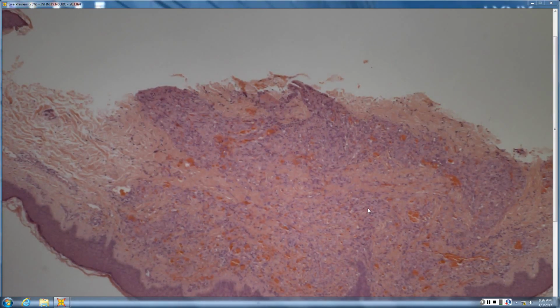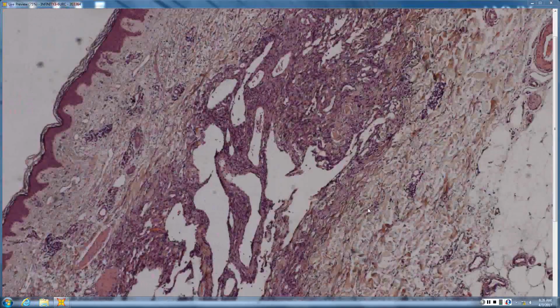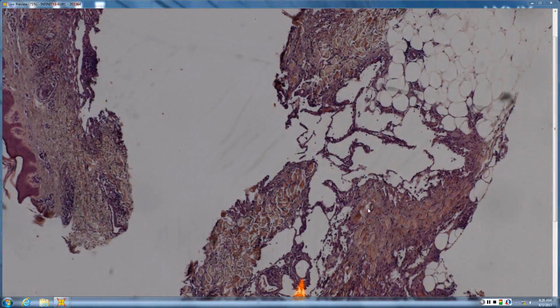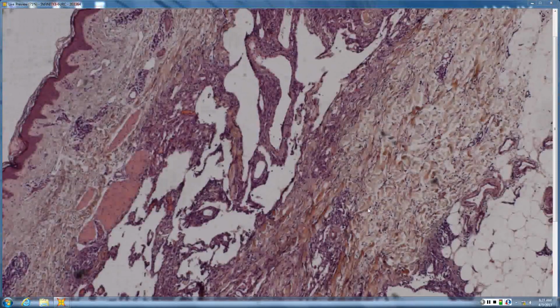Nodular vascular proliferation, nodular KS, or it is a little lobulated, maybe. And definitely around pre-existing structures, and this is an HIV patient and HHV8 positive. The deeper dermis, pretty diffuse. And what would you call this, where you have a vessel that's kind of sitting, floating, or jutting out like a promontory sign? So what would you think of? KS, and this is HHV8 positive. These are just very prominent promontory signs here in the dermis, the pre-existing vessels with stuff wrapped around them, jutting out.